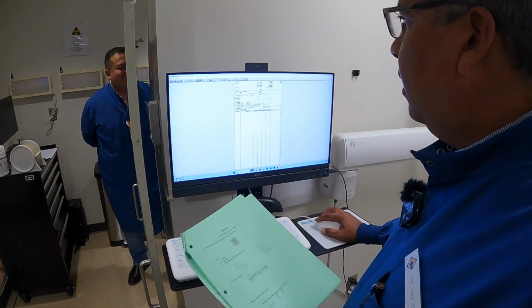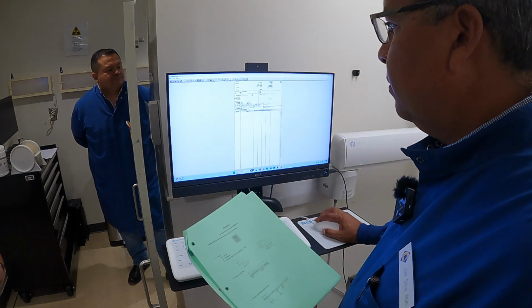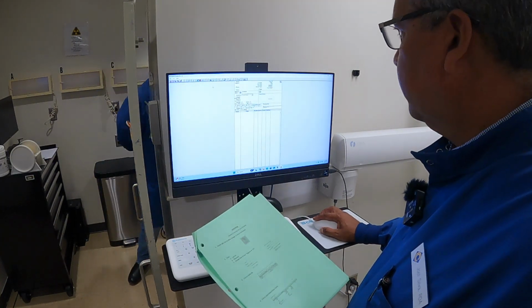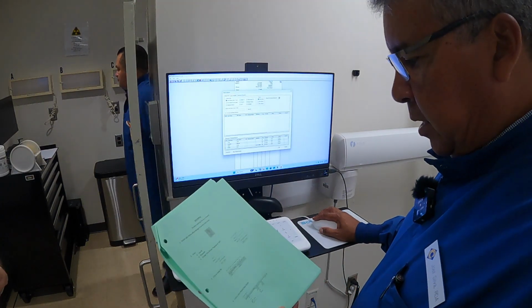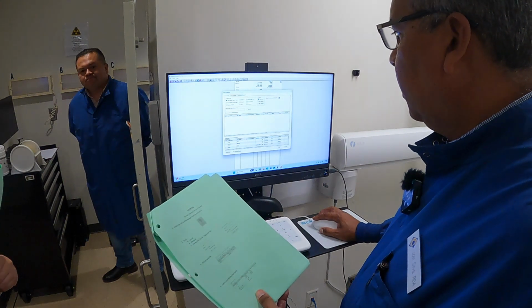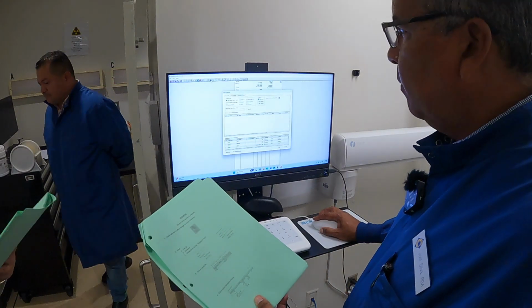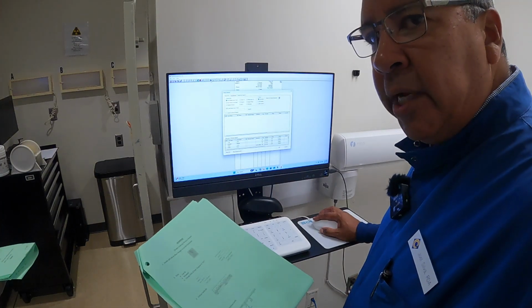and then, okay, then we can click on this little icon right there. So if you want to add that to it, I don't know if that is on there or not, but add this icon, and it is a little man with a little arrow to his right side.